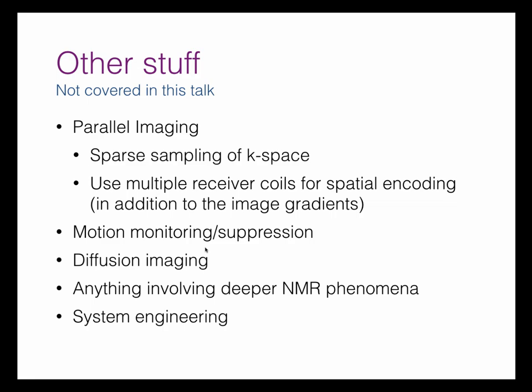Are there certain sequences that are better with motion than others, or doesn't it matter? Yes, you can tune your sequence a little to help with that. That was quite popular back in the 1990s. The problem is, these days there's not a lot of dead time in sequences to reacquire. So it depends on what you're trying to do.